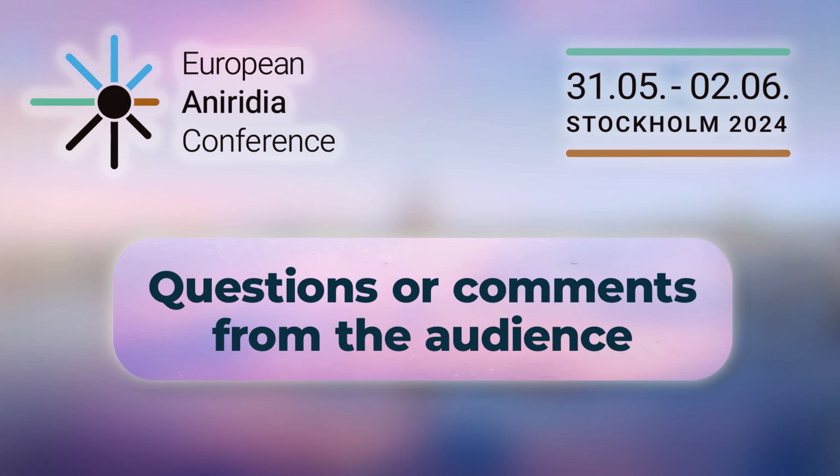That's the challenge. And many times we do use scleral contact lenses. It's pretty routine for us to do that, to get them back to some functioning if they have a decrease that we can identify in the cornea. That's the place for this lens in aniridia: the vision changes during life, which is really frustrating and problematic for patients and doctors, and we're sometimes trying to maintain what we have. So in that sense, I agree with your comment. It may not be 20/20, but we're happy with 20/60 or 20/100 many times, and that's much better than counting fingers due to irregular astigmatism and other problems with the cornea.